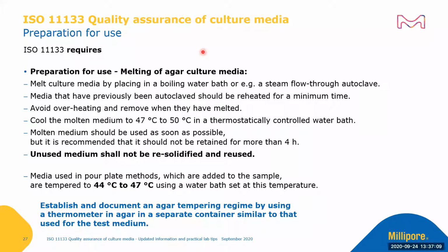ISO 11133 requires, for the preparation for use, the melting of the agar of the culture media. Melt the culture medium by placing it in a boiling water bath or in a steam flow-through autoclave. Media that have previously been autoclaved should be reheated for minimum time to avoid overheating, and removed when they have been melted.